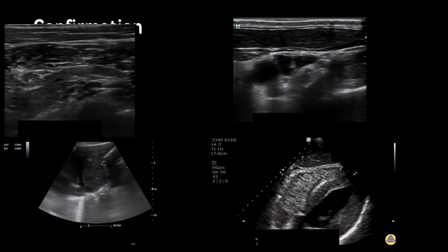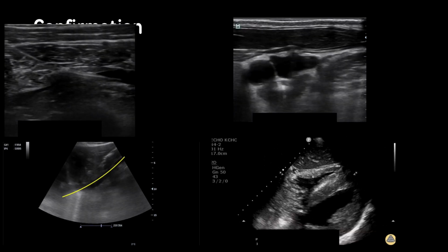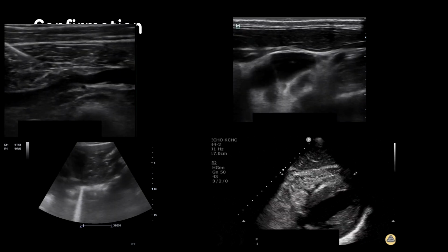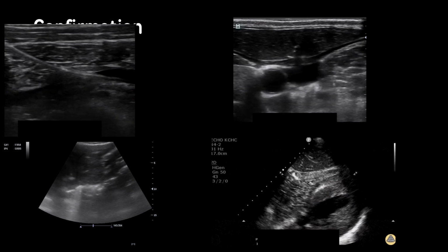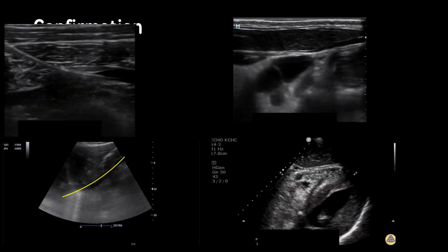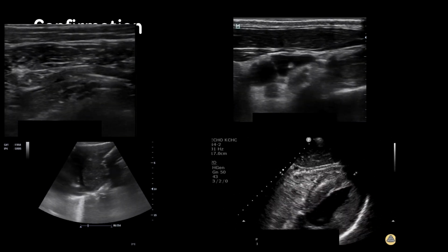That's not going to help. I mean, whether you put it in the femoral or once you put saline in, it's going to go up to the RV. So that doesn't help you. No. So whether it will just tell you it's in the venous system, not in the arterial system. But the goal is really here with a wire. Check the wire and see where the wire is.